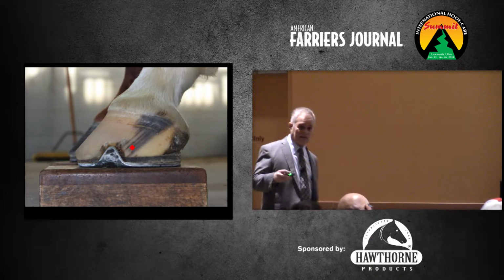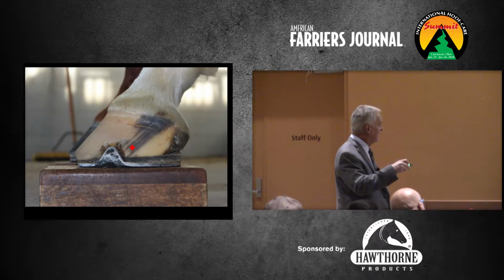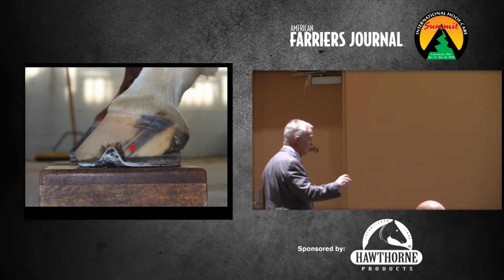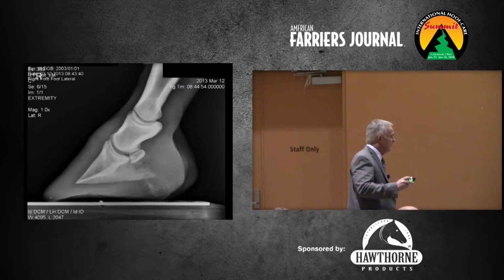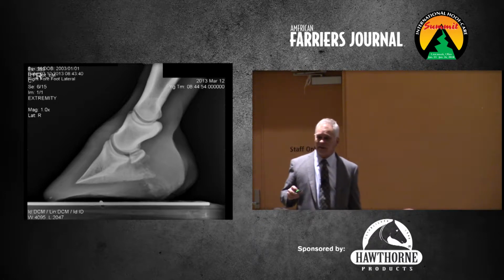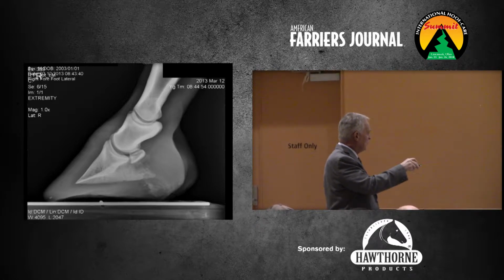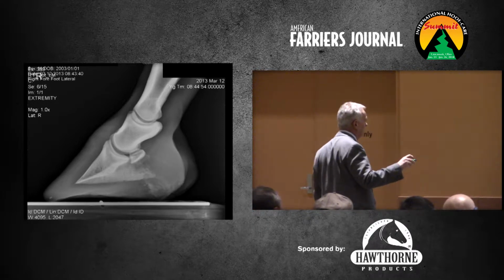Where would the vet likely center a lateral if they were shooting for a coffin joint? Yeah, so it's going to be right in here. And in theory, if they're doing a perfect navicular shot, it'd be a smidge back and a smidge lower. Okay, so it needs to be appropriate, generally the widest part of the foot. And this is the type of view that you would get. So vets would say, oh, that's a bad view because it's oblique through the coffin joint, but that's not what you guys need. You're trying to evaluate sole depth, the palmar angle, is the bottom of the bone level, and things like that. So that's an appropriate view.